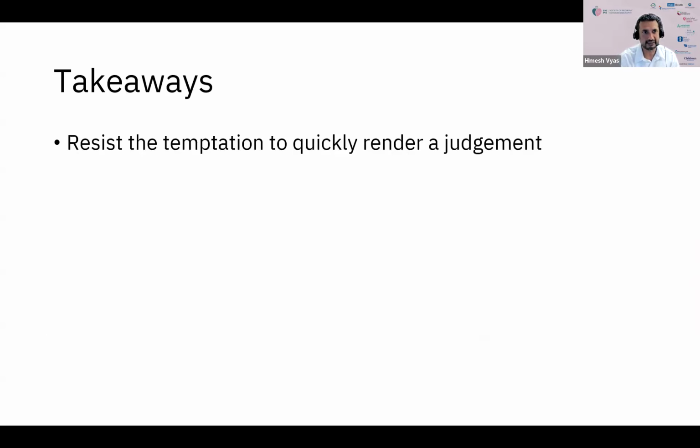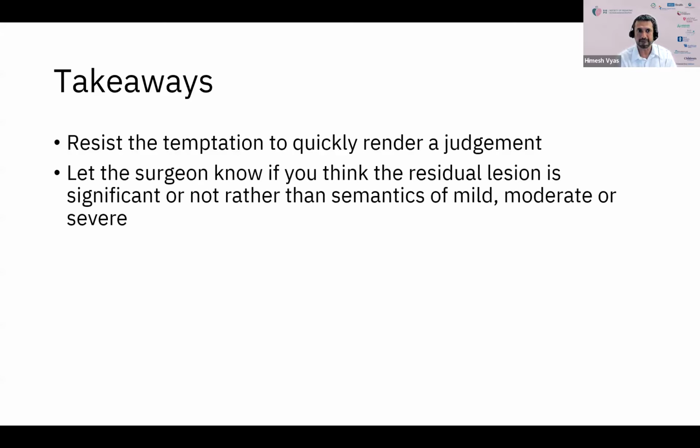So a couple of takeaways that I'd like to suggest: resist the temptation to quickly render a judgment. This is particularly applicable to folks who are new and are doing TE for the first time, or are a new attending, and you have an experienced surgeon. A lot of times, and I experience this as well, when you go to the operating room and you get the first one or two images and things may look okay, your surgeon may tell you, yeah, that looks great. And you feel the desire to say, yes, that looks great. But resist that temptation. Take some time to get your imaging and then make your statement.